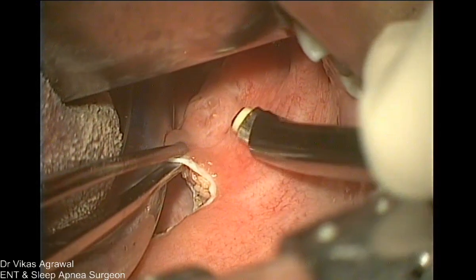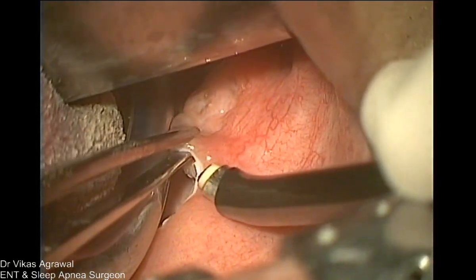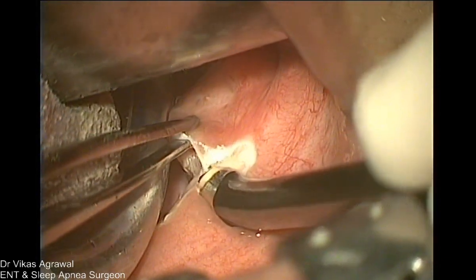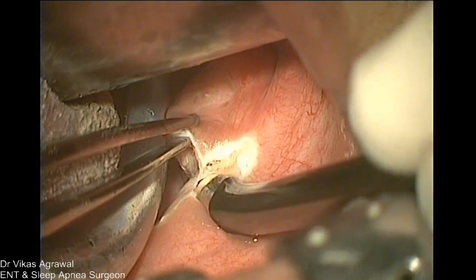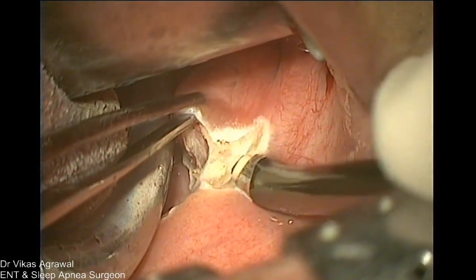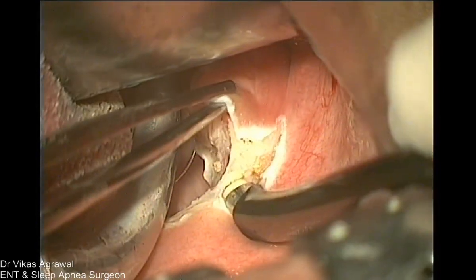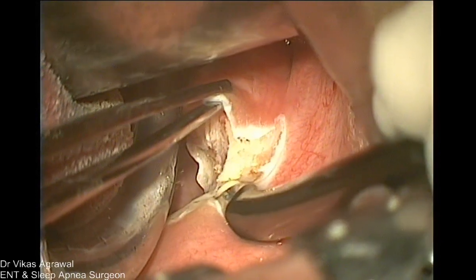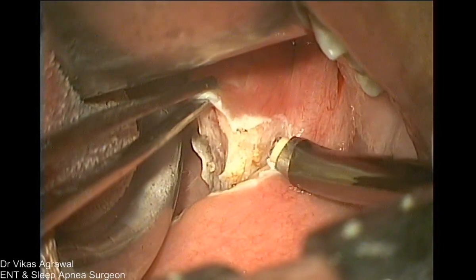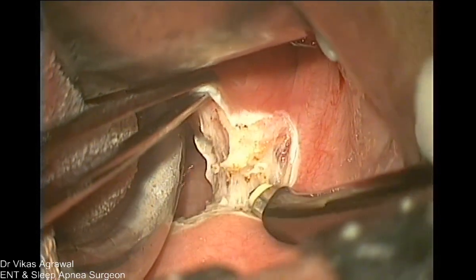Okay. So this is the anterior pillar. We are only going to enter the anterior pillar, not completely remove it, so that we go into the supratonsillar pad of fat again. See, there is sometimes a vessel at the upper pole of the tonsil also, and you have to be careful about it because it can cause really nasty bleeding, a secondary bleeding in the post-op period. But most of the time it is the tonsillar artery which is the trouble.